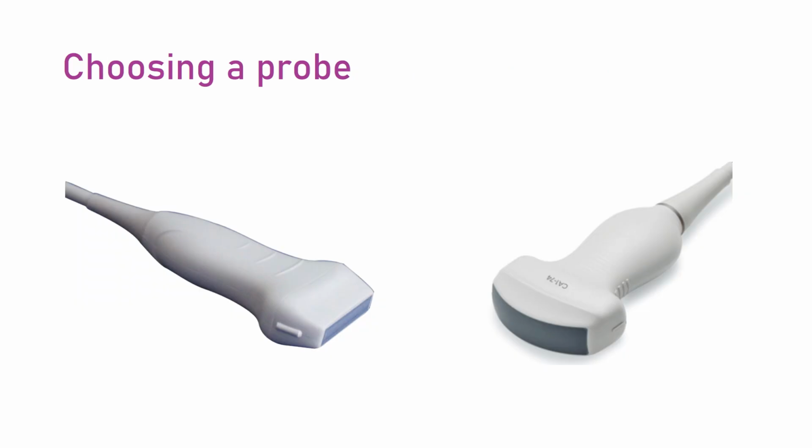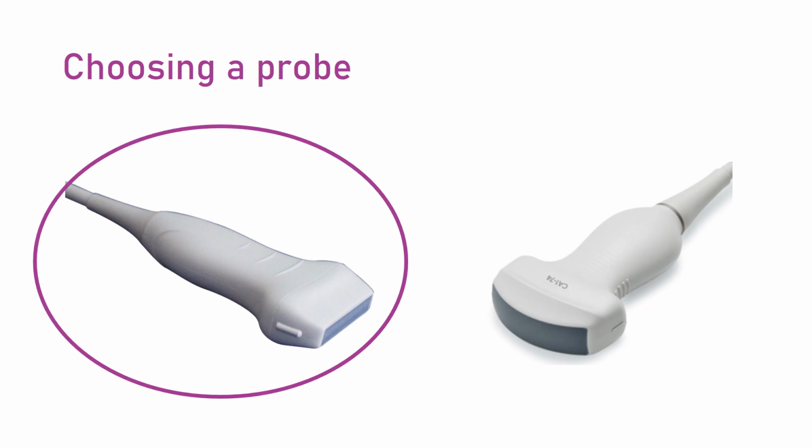When we're talking about which probe to use to detect the EPSS or intraperitoneal free air, actually the one in favor is the high frequency linear probe, where we can see a lot of detail. Of course, whenever you are looking at the abdomen with a convex curvilinear probe and you see the EPSS or some signs of intraperitoneal free air, that is just fine.